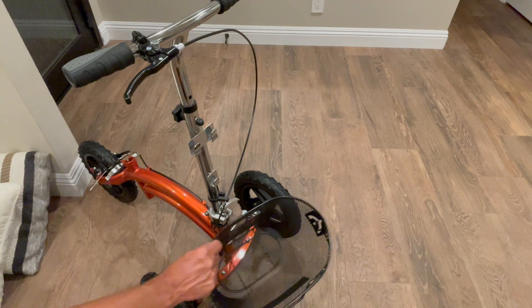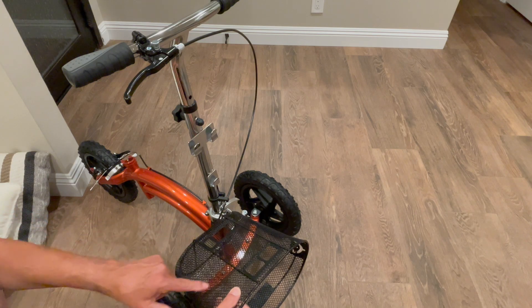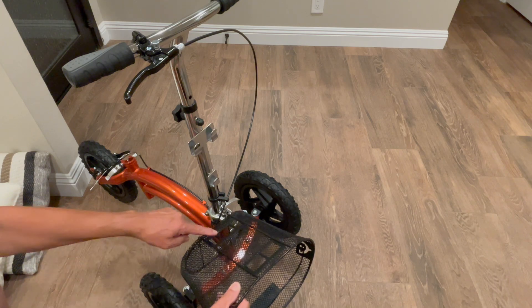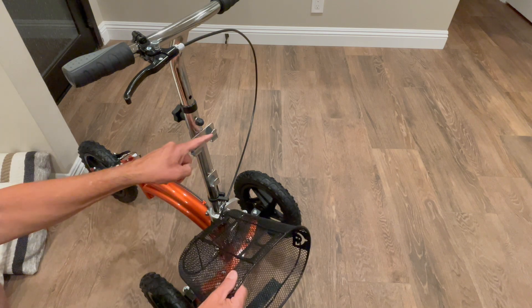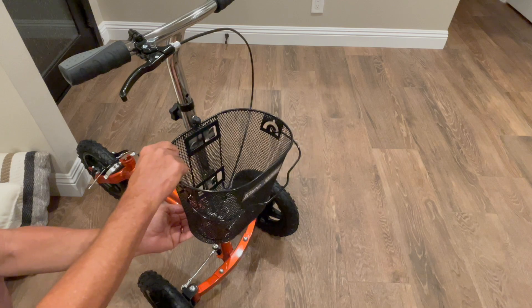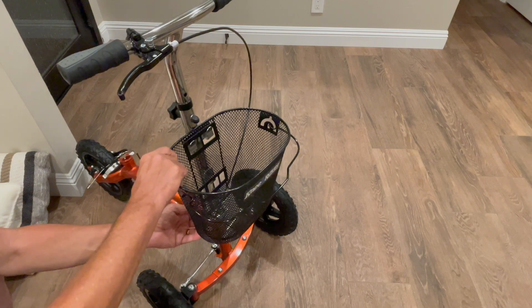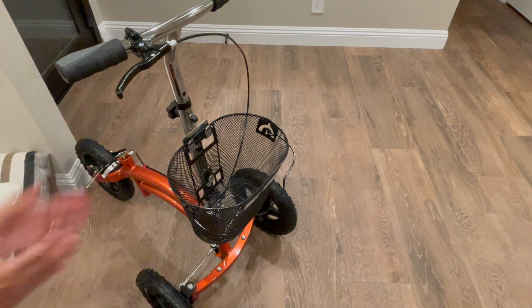They've made this basket super easy to install. You can see this square here and these two squares — this one slides into there while these two are sliding here. The best way to do this is come in, catch it high with the two up here, then catch the low one, push down, and they're locked in.